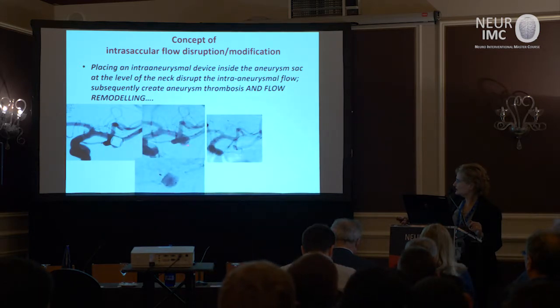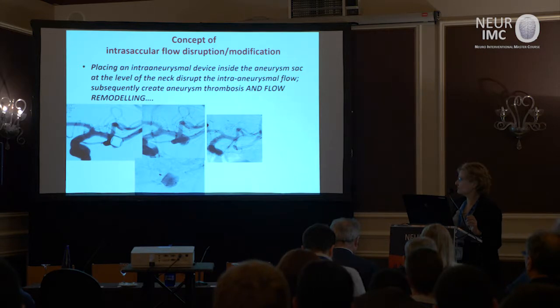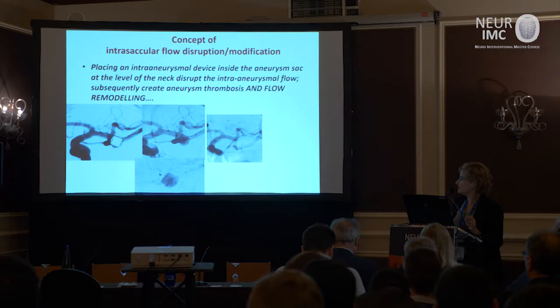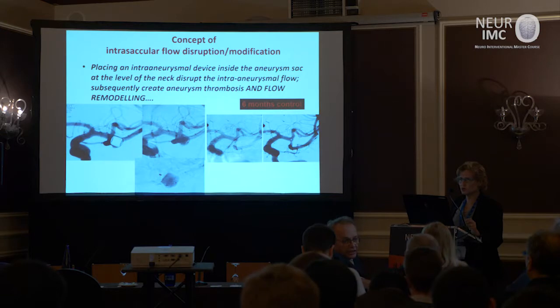This is immediately after the placement. Good contrast stagnation. If you wait on the table and the patient is not on anti-aggregation, you may see even immediate occlusion as well. But this is the 6-month control on this patient. Usually, however, it takes a very short time to have an occlusion.